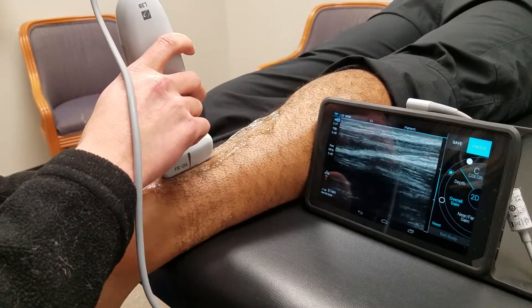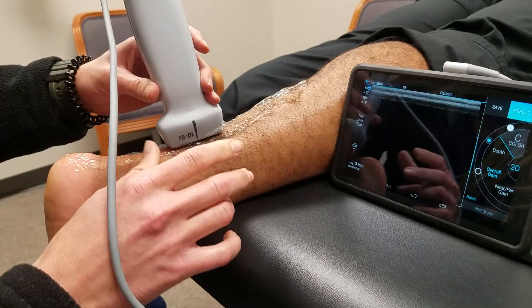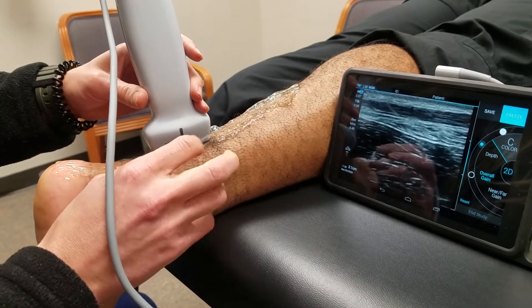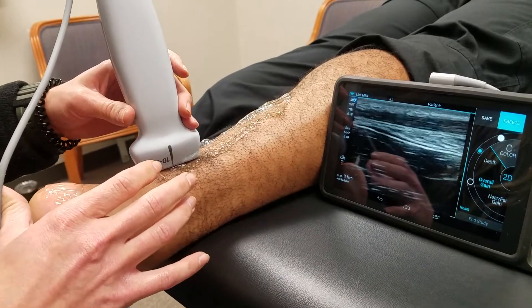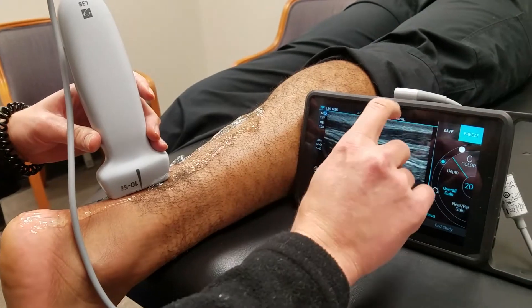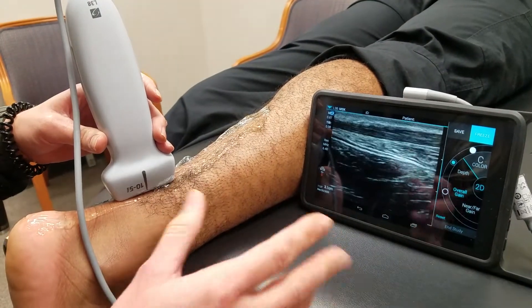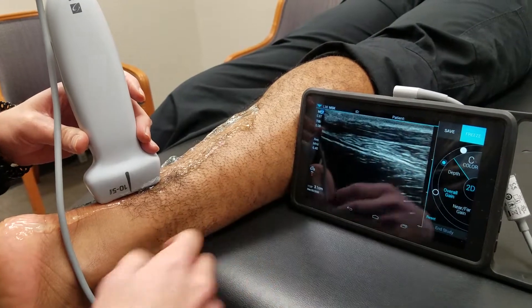Now if you have a rupture or a tear, you're going to see maybe a discontinuity in there. Or if there's just a tendinopathy where you're having some tendon pain in this area, it may appear a little darker or it may appear a little thicker. Now if there's a rupture, there may be some separation as well, and this part is going to be a lot bigger.